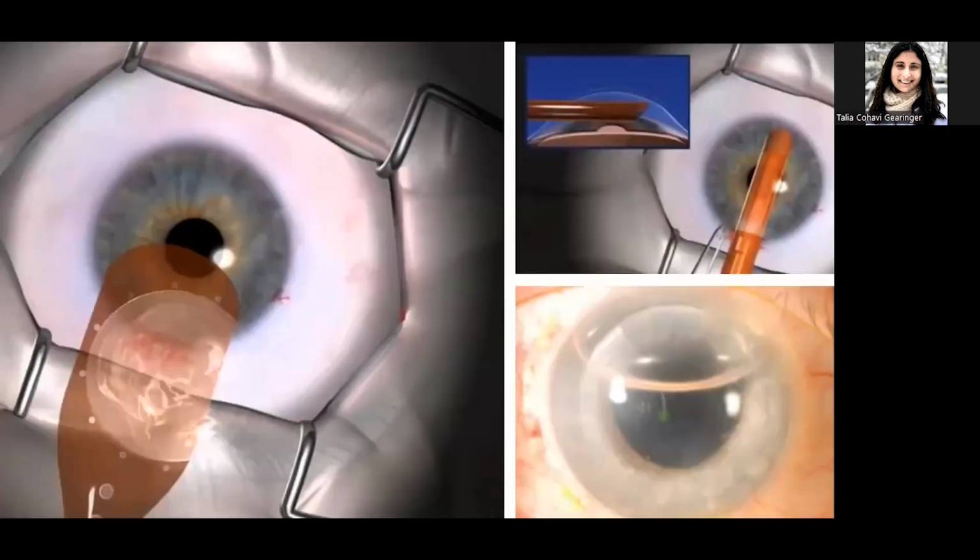So this is a little bit about the surgery. This is the disc that we cut for the corneal transplant, this is how it looks. And this is an injector that not everyone uses, but we use it pretty often here. It's called the endoserter. And this is kind of folded, and then you can see it here on the top right. So it's a little tube.